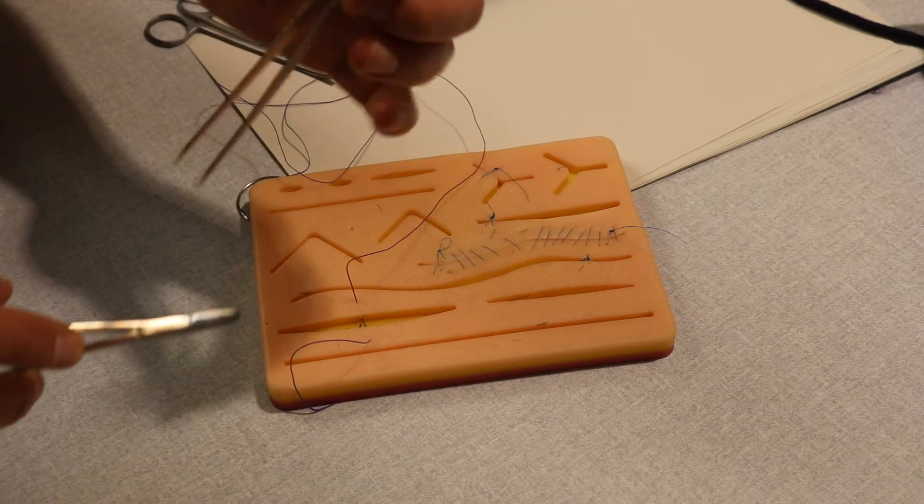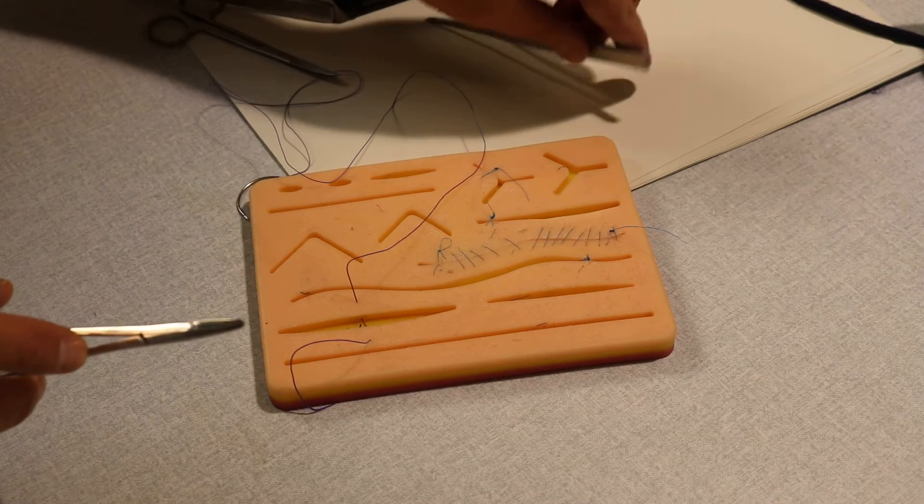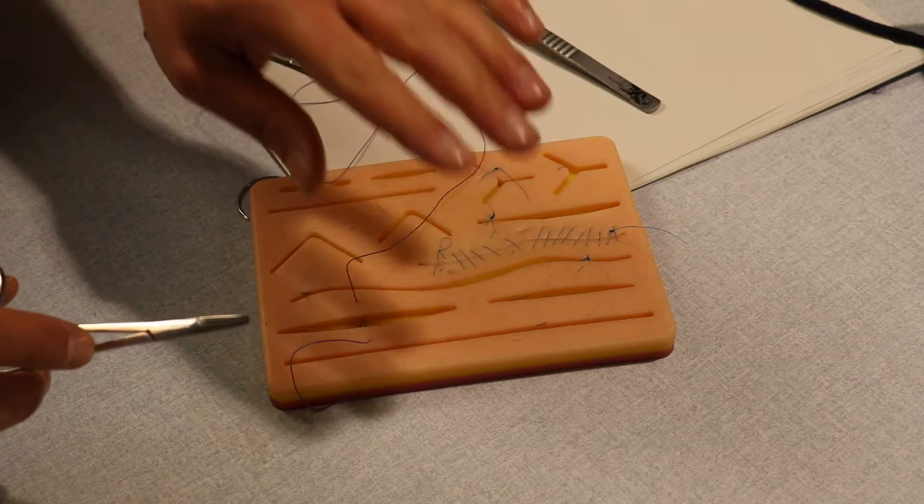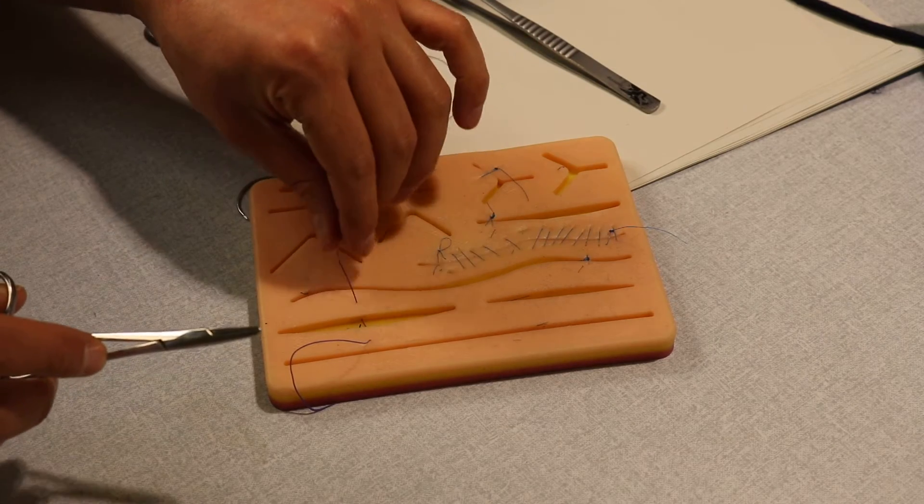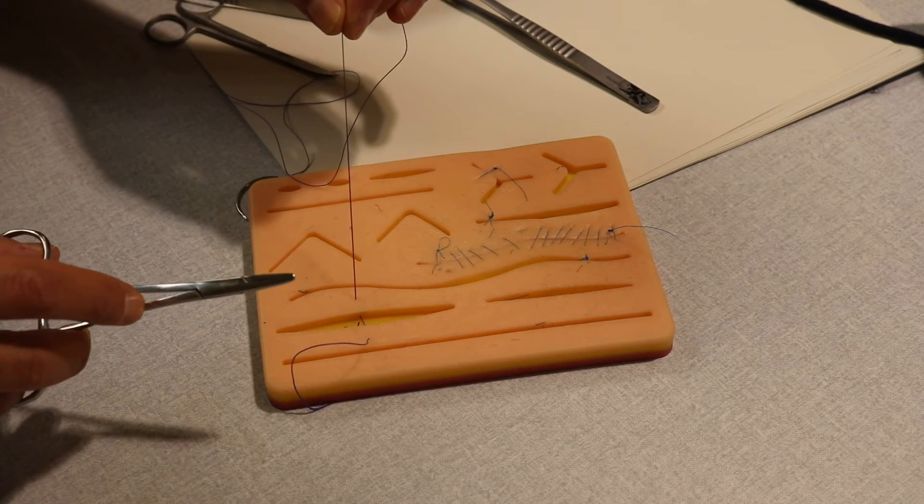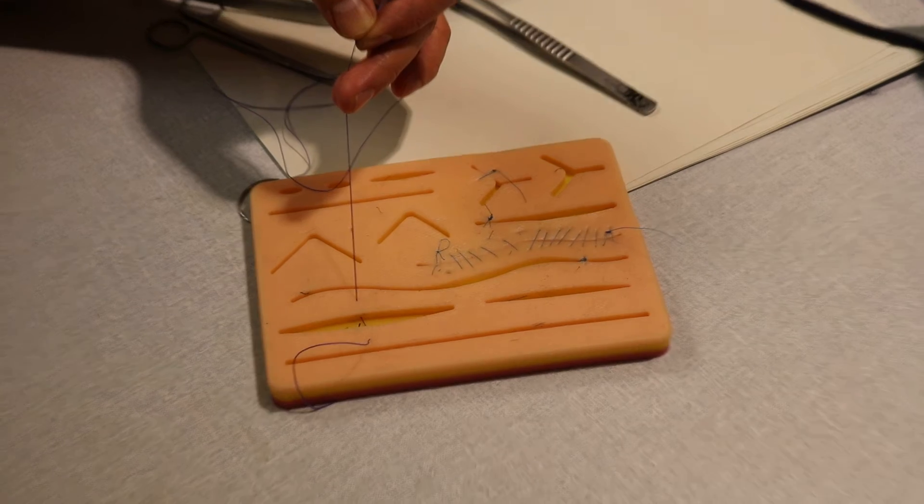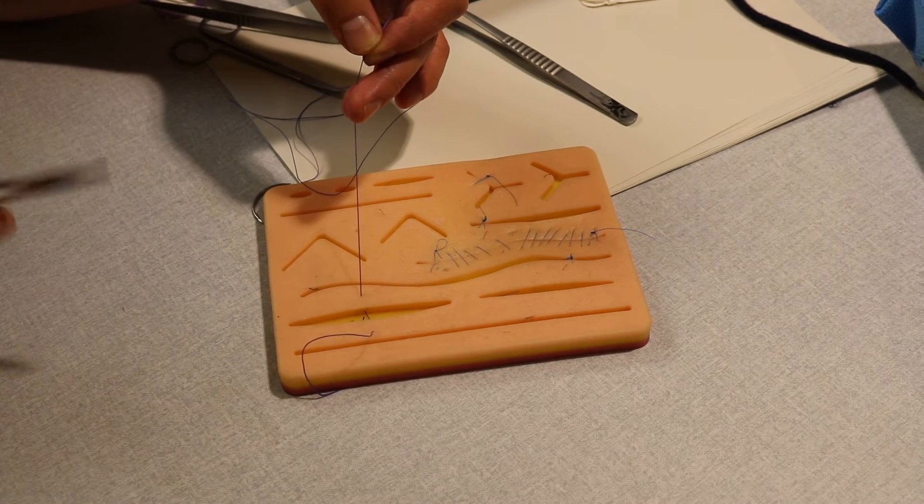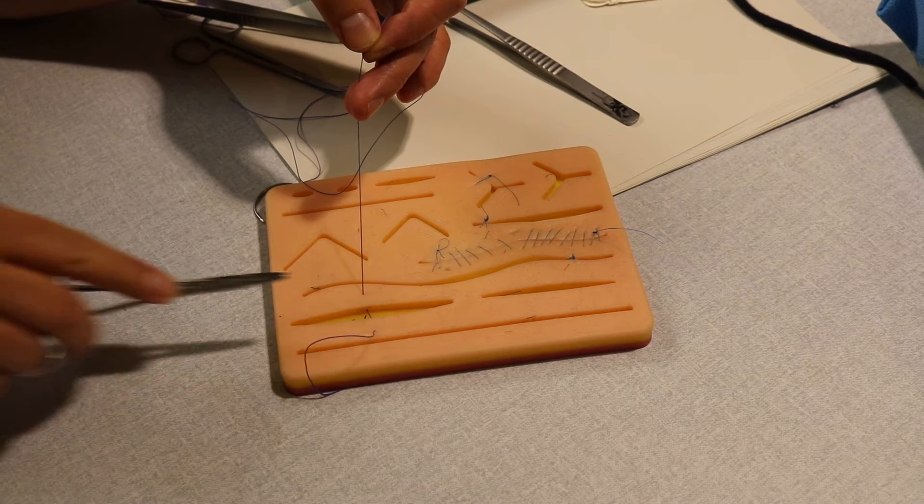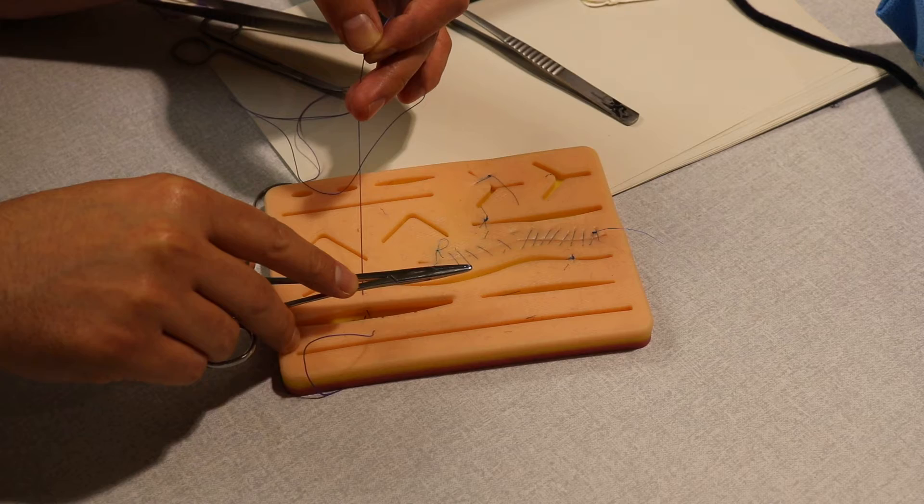You can get rid of the forceps, put it away, and hold the long thread. I'm now holding the long thread. Bring the needle holder parallel to the wound, exactly like this.